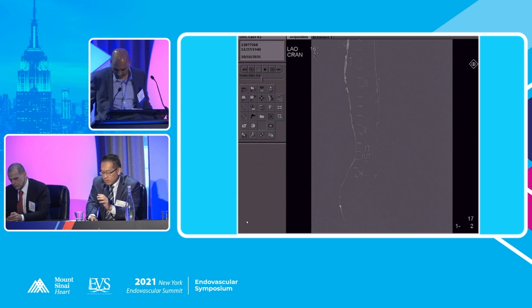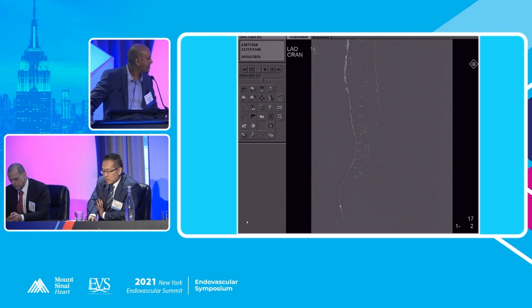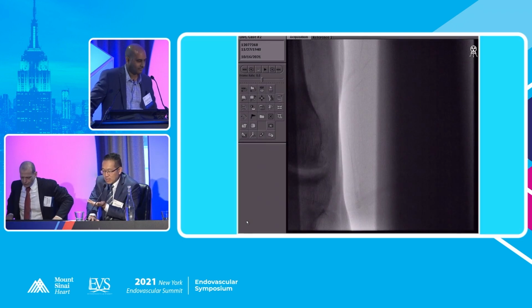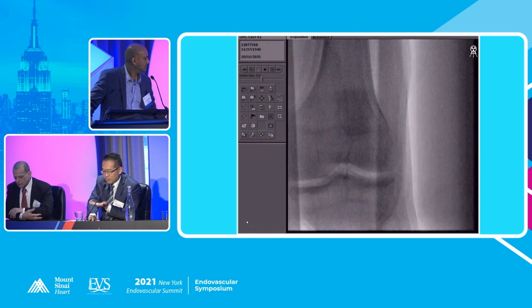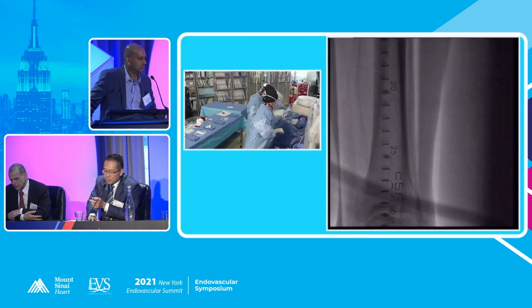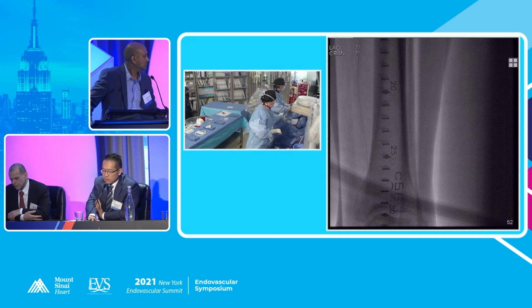Yeah, I think I agree with this gentleman here. Common femoral is still a place I stop a lot of times and at least get a consult, talk to the patient. I think with the three vessel disease, obviously, I would lean more towards doing endovascularly. And this guy, he had a good result in the right leg. He's not going to go to surgery. He's going to say, do the same thing to me on the left. So realistically, probably endovascular left, whatever it was, Shockwave, DCB, CSI, something. And then I missed where the wound was, but I probably would just do the same thing, see how the wound progresses and not do more unless I had to.